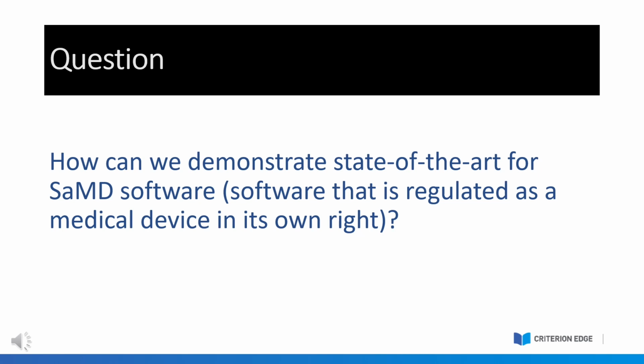You also want to look at alternatives. If you weren't using this software, what would you be using? What are the choices? What are the treatment options that people have to choose from? Your software or what? What is the alternative? You want to compare it to that as well.